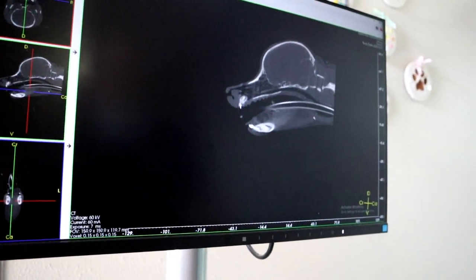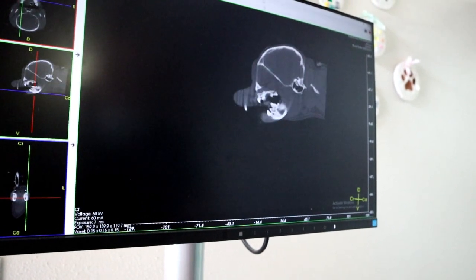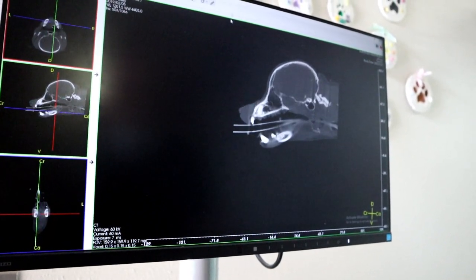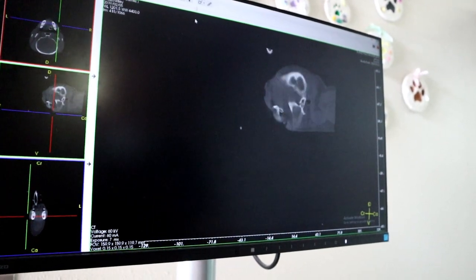Let's switch back and forth, checking all the different views, making sure that we have all the molars — awesome — all the way through to the pre-molars. The pre-molars look a little bright, but that's okay. We've got all the teeth so far.